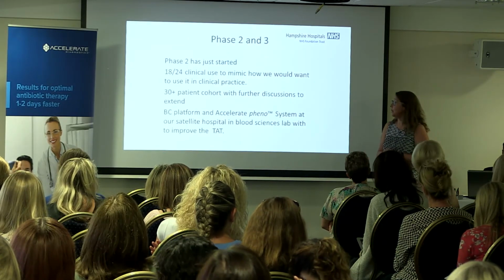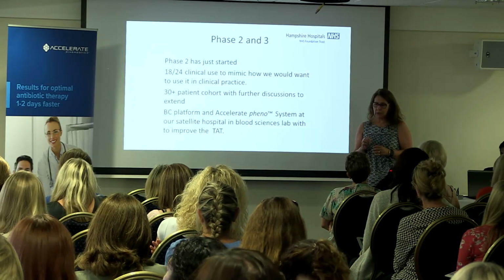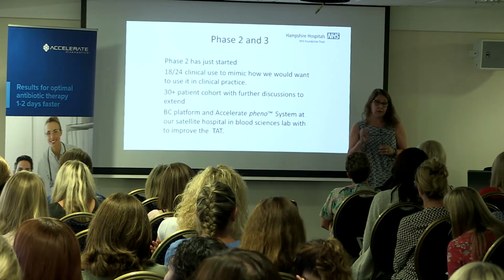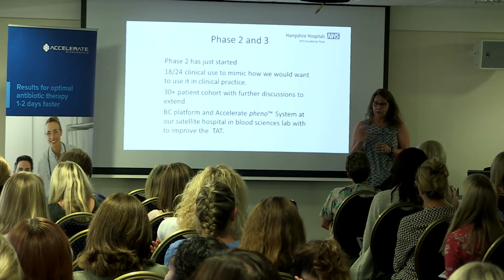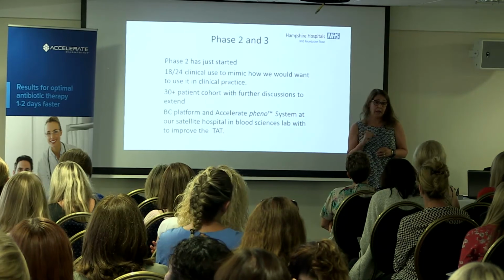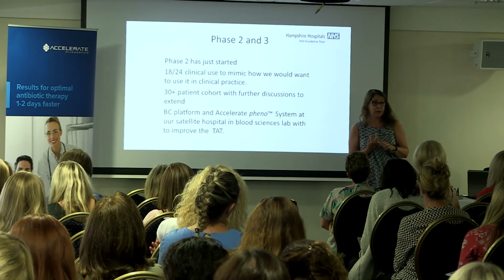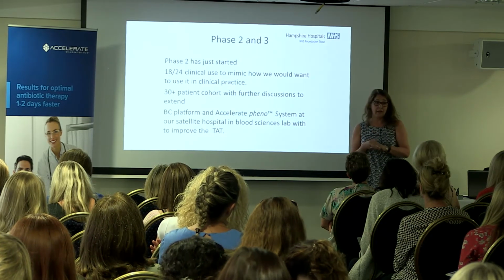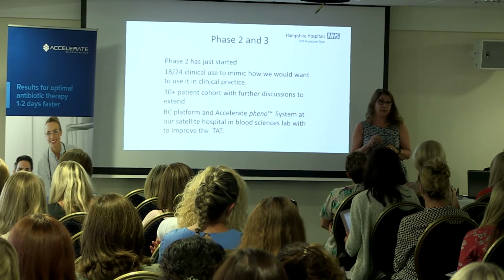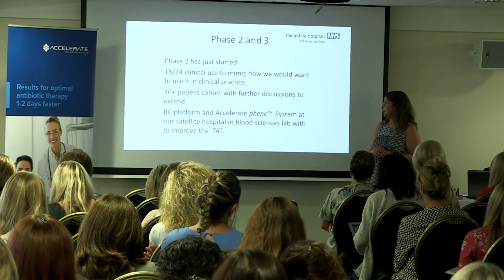We've now moved on to a second phase study. So we now have a system where we, as consultants on out of hours, can get the ID and the sensitivity. So the BMS just puts it into, starts the machine going, and they can do that any time up to 8 p.m. when they leave. I will then get an email telling me there's one on the system. An hour and a half later, another email telling me what the ID is, and then 4.5 hours later telling me what the sensitivities are. So I can genuinely start to change antibiotic treatment overnight. And we're in the middle of doing that now, and it's working quite well.